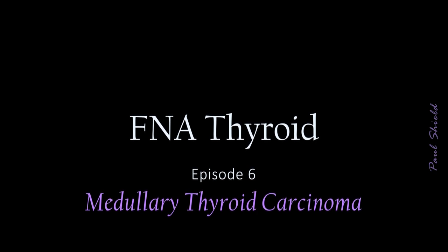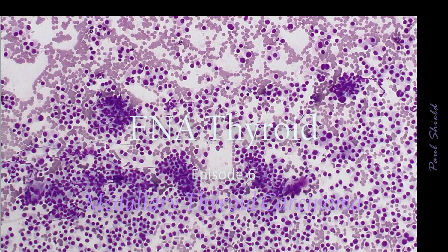So this is a difficult cytologic diagnosis, partly because of the highly variable pattern of presentation, and as a result, the wide range of differential diagnoses that can be brought up. What I'll do is look at a couple of cases that illustrate probably the most common pattern that's seen, and some of those features.